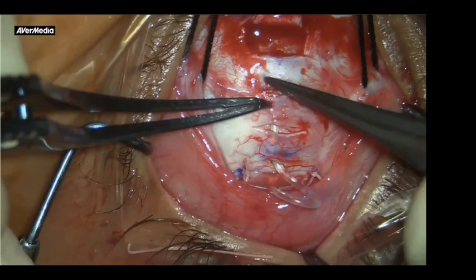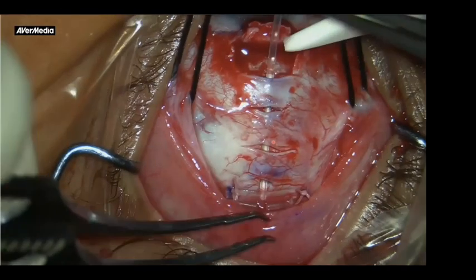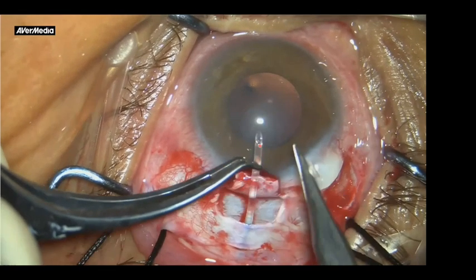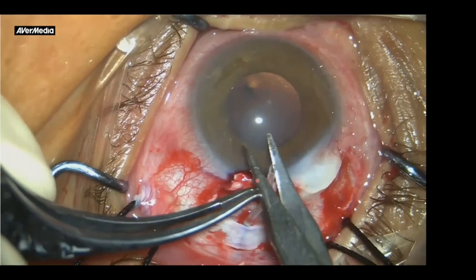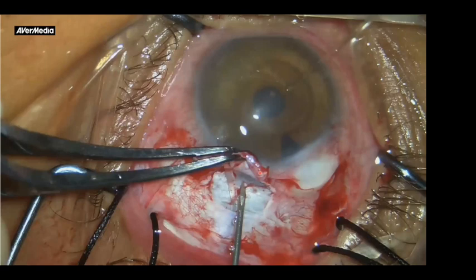So it's again just connected. They are all connected together. And then once you have this appearance, you will cut the extra length of the tube. Again, the remaining part of the tube is relatively small. You make it beveled, and the bevel is towards the cornea. If it is toward the iris, it can occlude it.